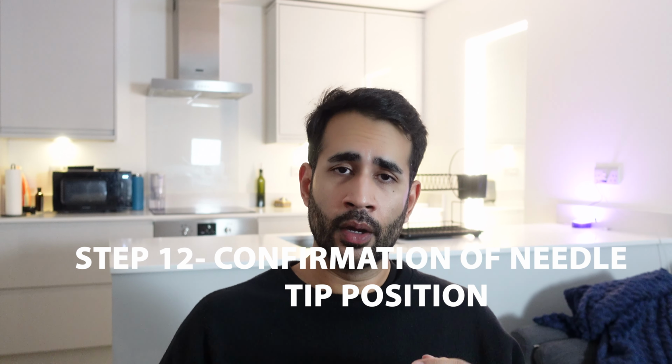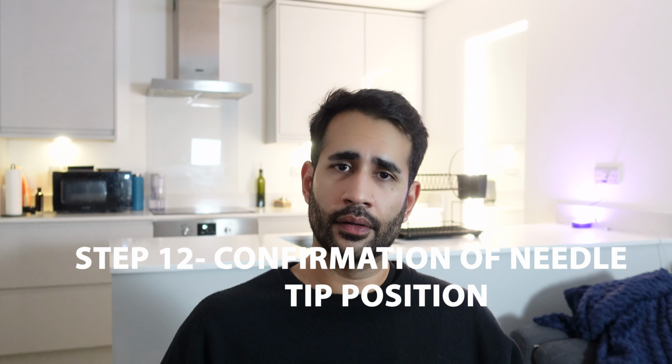needs to go. So once you get down close to that space, usually they'll be talking you through this as they're getting close to the right area. And then once it's into that space, the needle tip position is usually confirmed, generally by injecting either air or some contrast, which lights up on the CT scan as well, and it tells the radiologist that they're in the right space.